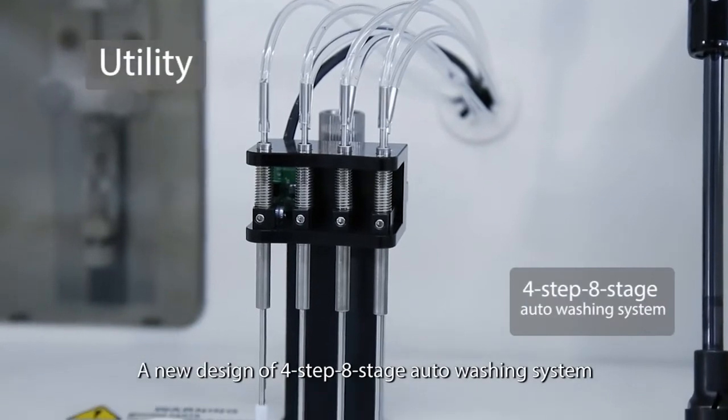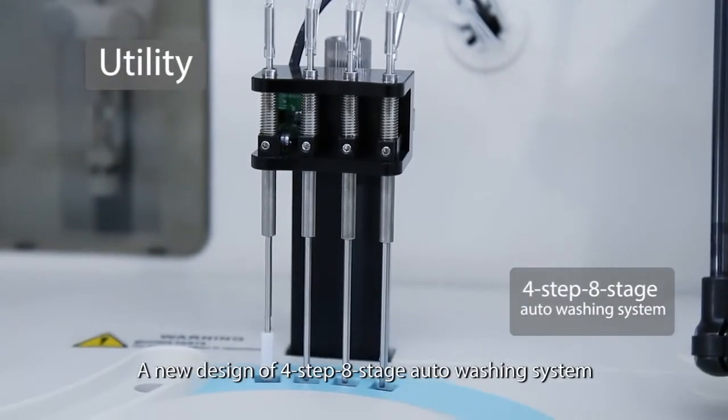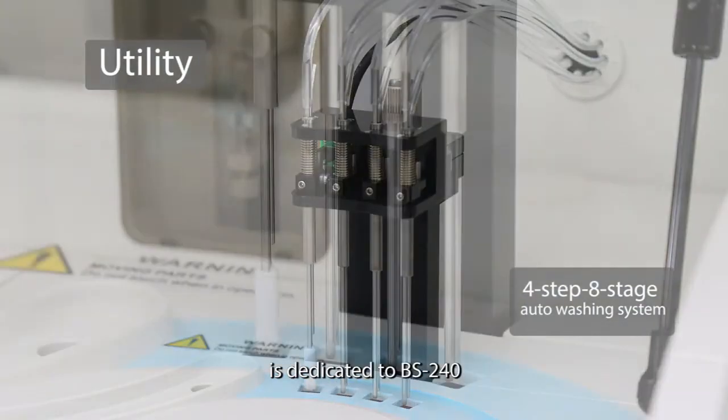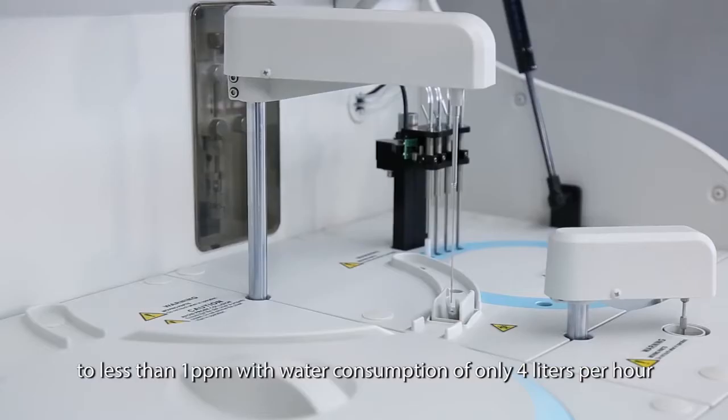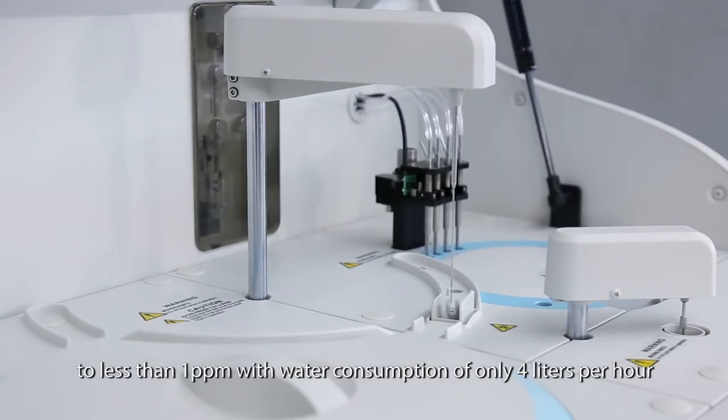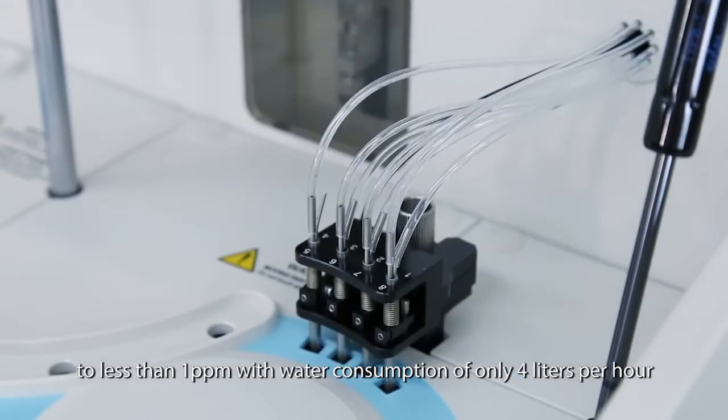A new design of four steps, eight stages, auto-washing system is dedicated to BS240. This advanced washing station minimizes the carryover to less than one part per million, with water consumption of only four liters per hour.